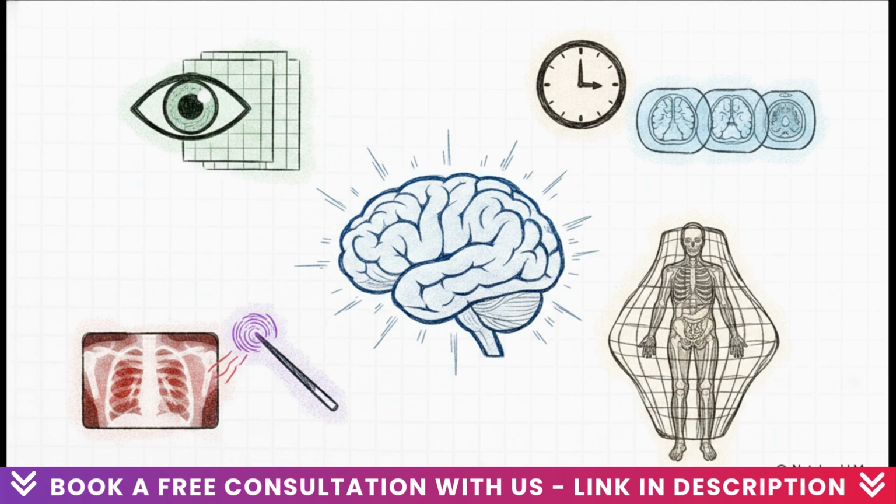We also use RNNs for looking at sequential 3D slices over time, GANs for generating synthetic data, and increasingly we're seeing transformers, which are fantastic at grasping the global, overall context of an image.